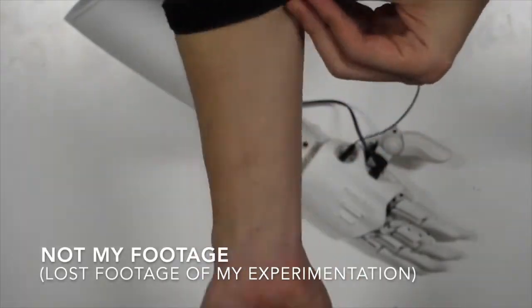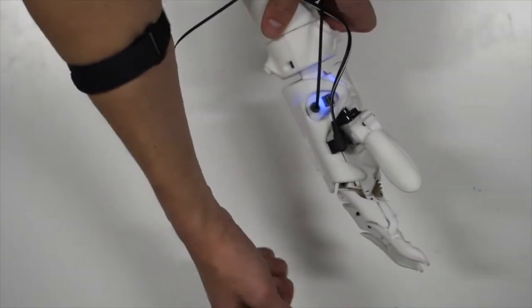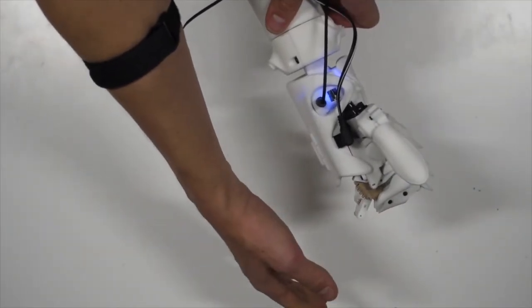Typically, the user equips a simple muscle sensor connected to the microcontroller board through a stereo jack. If the arm muscles are contracted, the hand closes. On the other hand, if the arm muscles are relaxed, the hand opens.